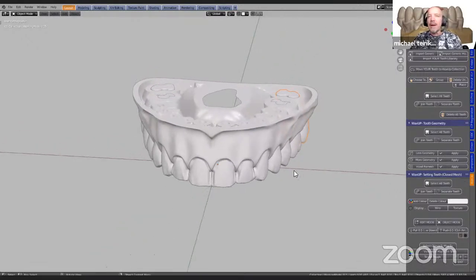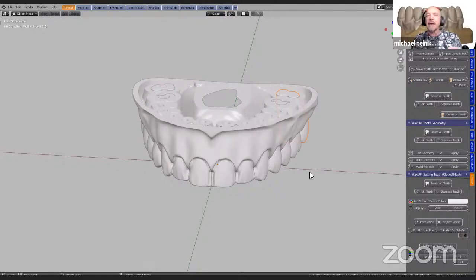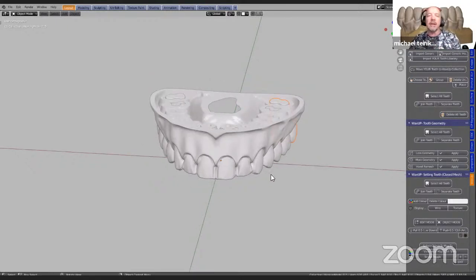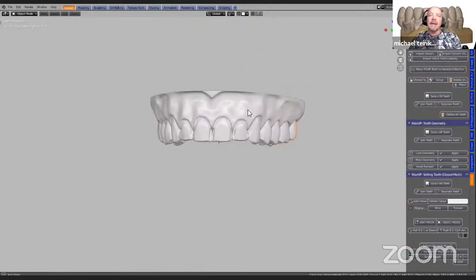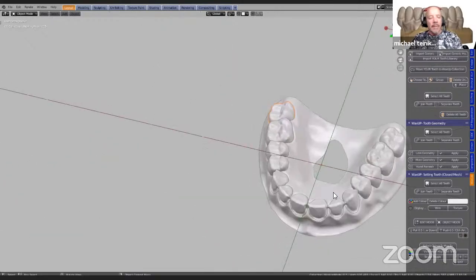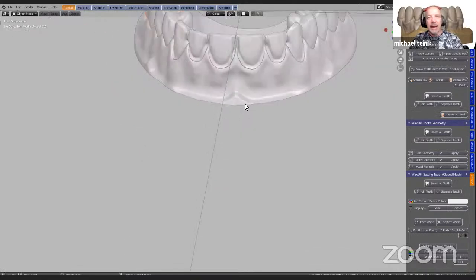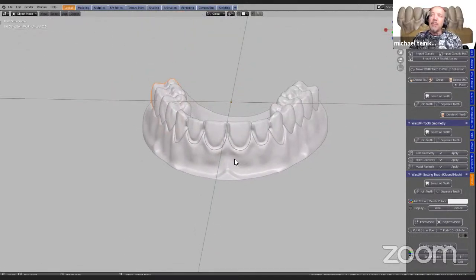Now, every program is different. Some programs, if you import the models into Blender, they're standing face up. And this one, we're working in a different orientation. I don't have a lower model for this, so what we're going to do is just go straight ahead and proceed and take it as it goes.